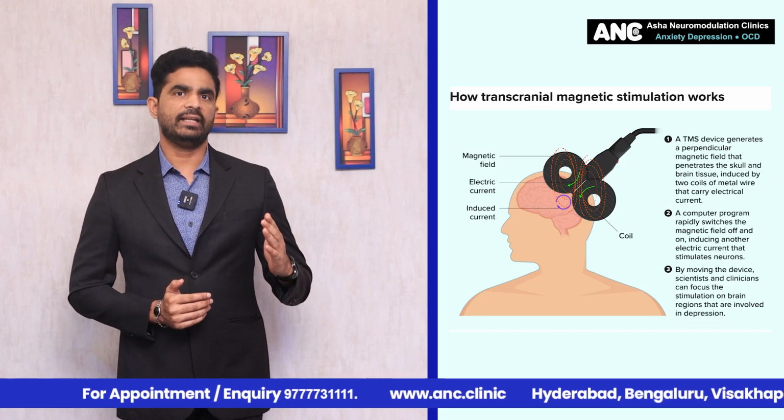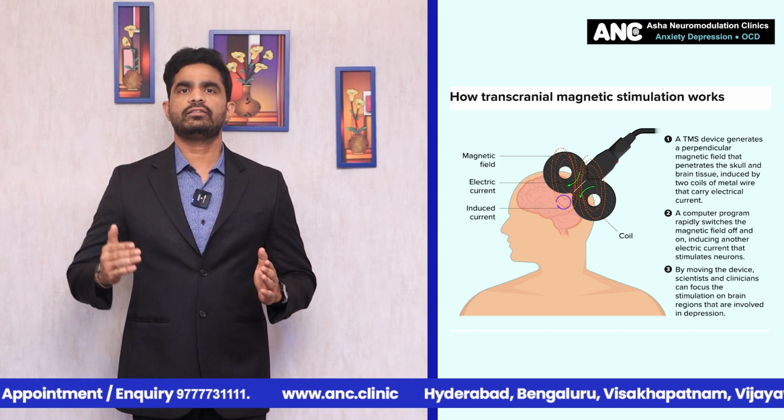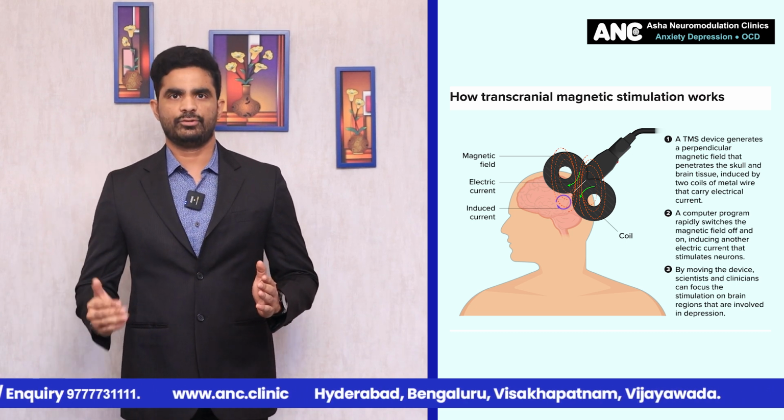So if we see the effects of this TMS on the brain tissue, they could be the effects due to the induced electric field and the effects due to the magnetic field also. Alright, so these are classified more or less as the classical and the non-classical effects of TMS. Coming to the classical effects of TMS.